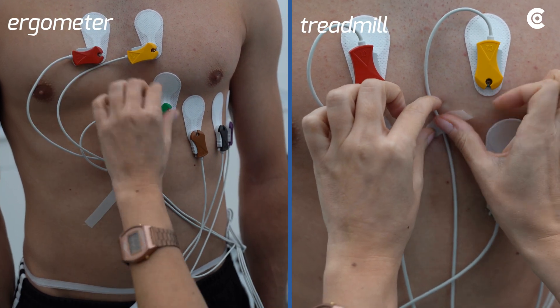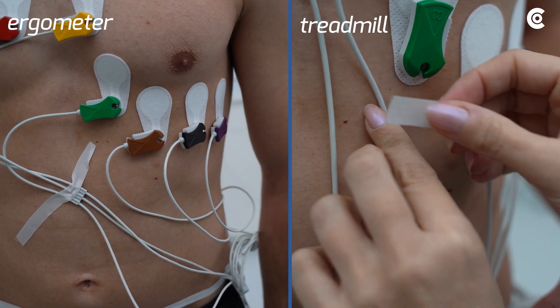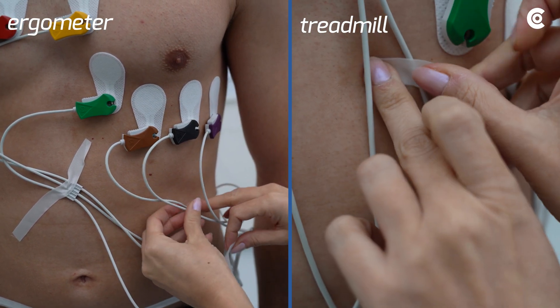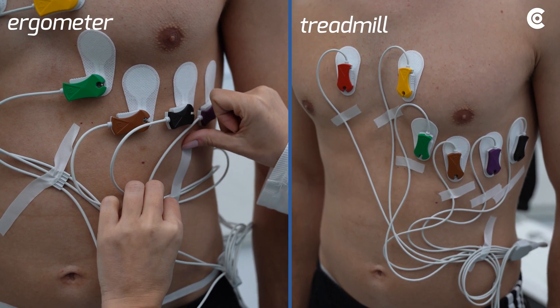Fix the cables with a suitable fastening tape additionally. When using a treadmill, each cable loom must be fixed individually. It is important that there is no strain on the cables and the patient's mobility is not restricted as far as possible.